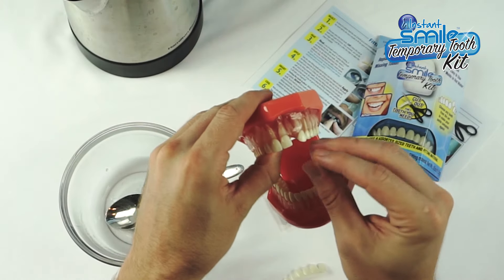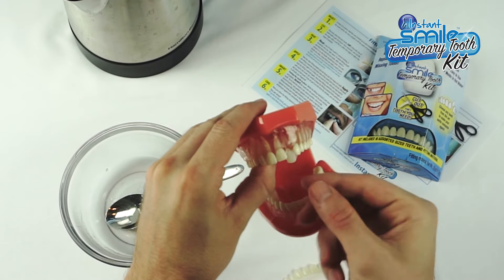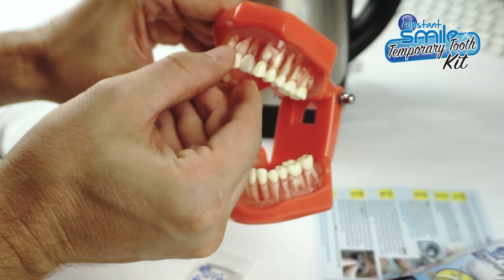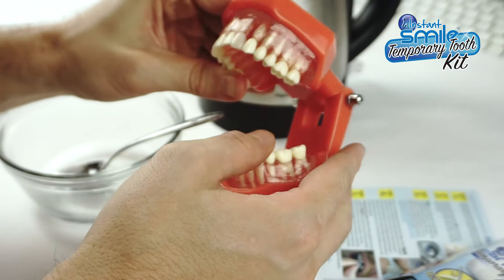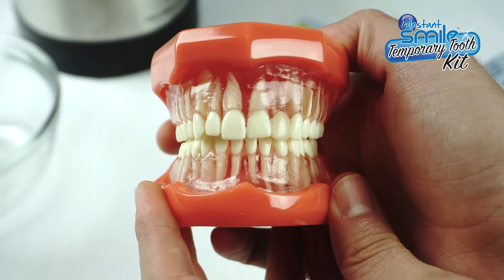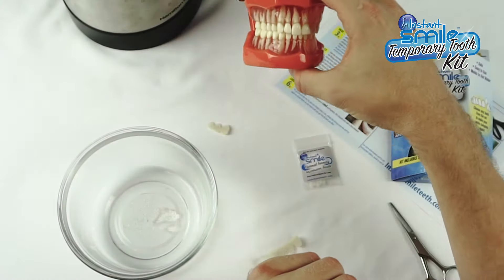Gently ease your new tooth into place. With your fingers, pat the fitting material behind the adjacent teeth. In about five minutes, the fitting material will turn white like its original color. At this point, it will be rigid and hard, securely holding your new tooth in place.